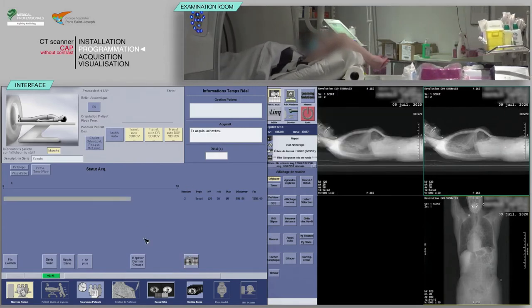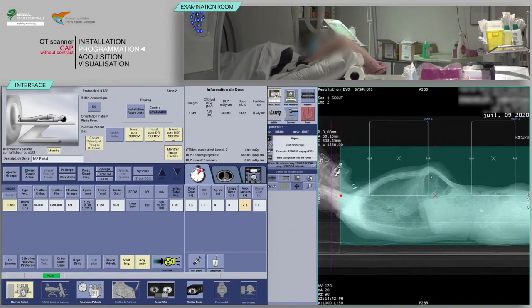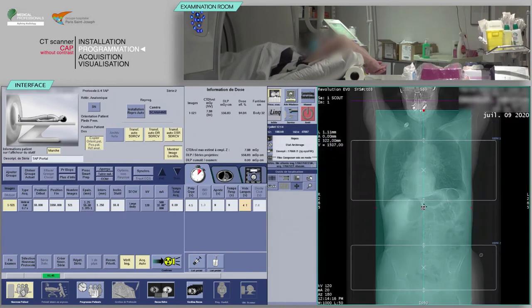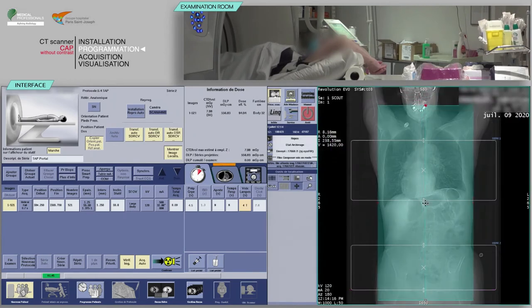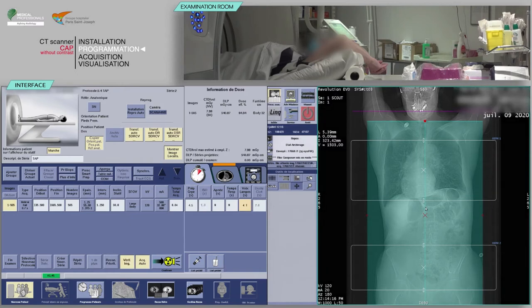Click on Next Series. Place your slices box on the frontal or AP localizer image in such a way as to cover the apex of the lungs superiorly and the ischial tuberosities inferiorly.